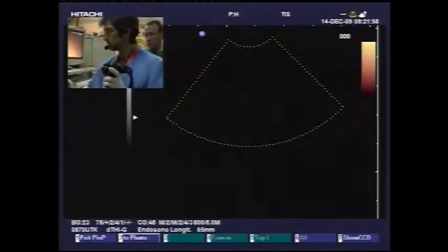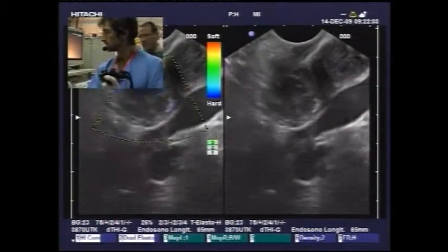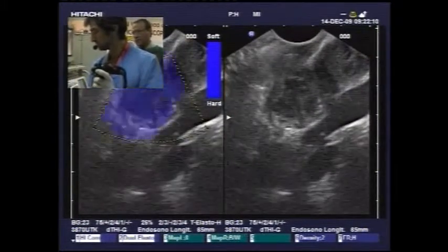Okay, so we're going to biopsy here. So I think that we can biopsy this lymph node. Hello, can you hear us? We can hear you, yes. Can we ask you some questions whilst you're having this discussion? Yes, please.